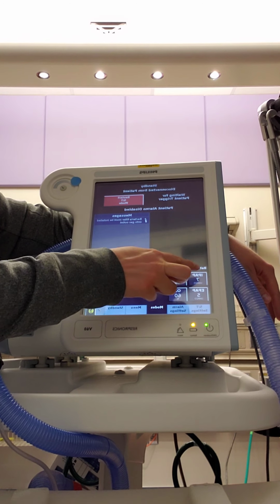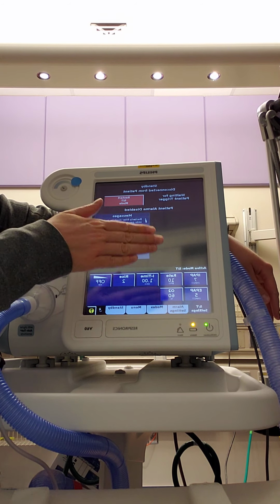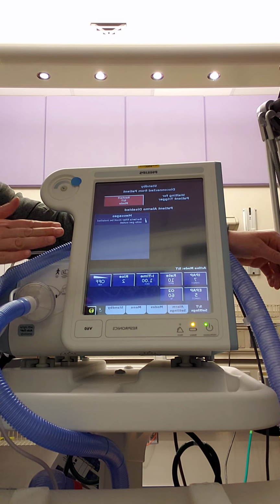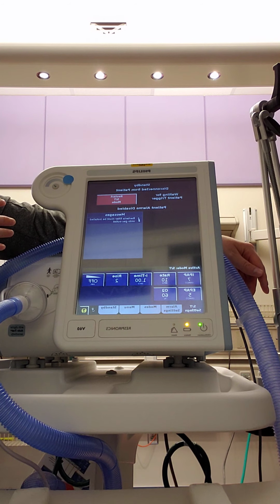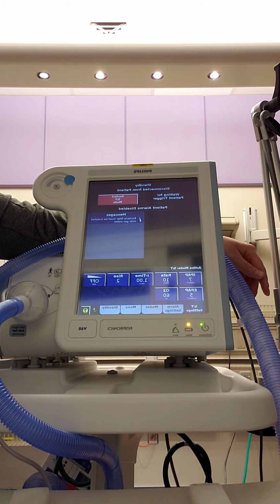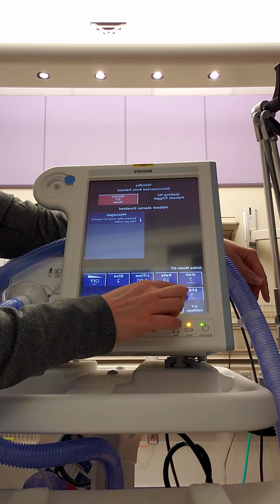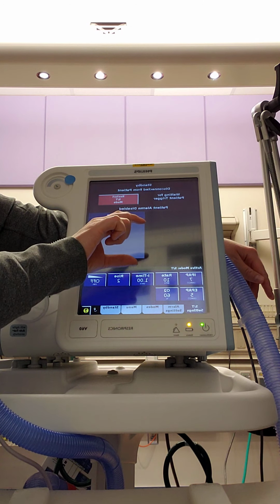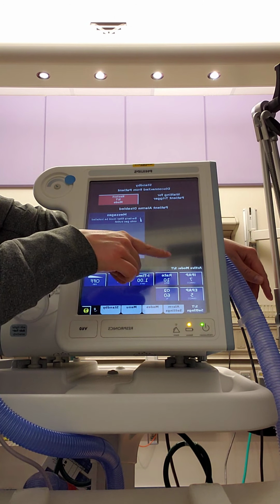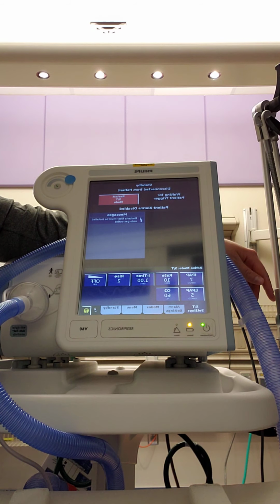The difference between the two, what you'll commonly hear it called, is the change in pressure or the delta P. So, it's a little easier to see. So with the BiPAP, it doesn't automatically change. So if you have a patient that is having oxygenation issues, if you increase your EPAP by 2, in order to keep that same window of ventilation, we would increase our inspiratory pressure by 2. And I'm going to go over that again after we go over all these settings.